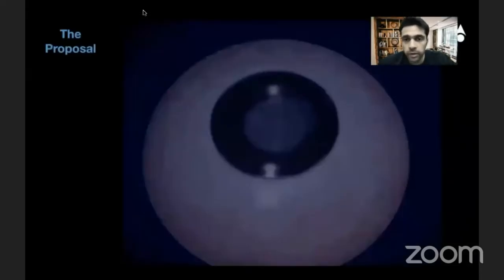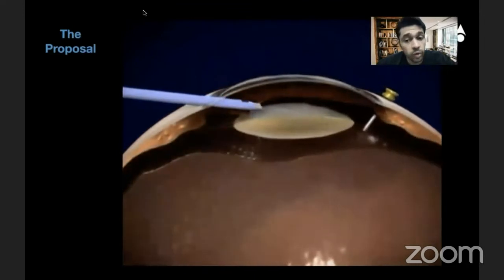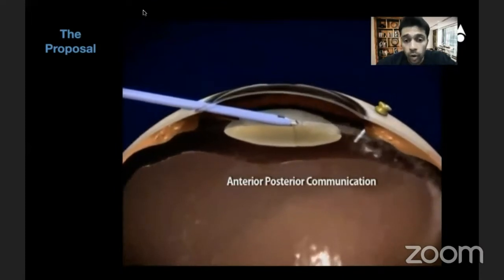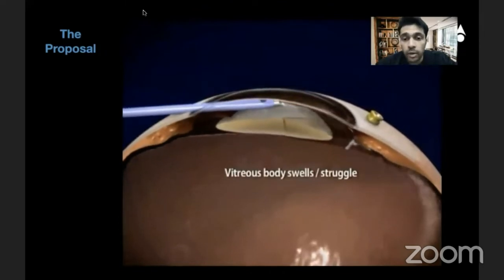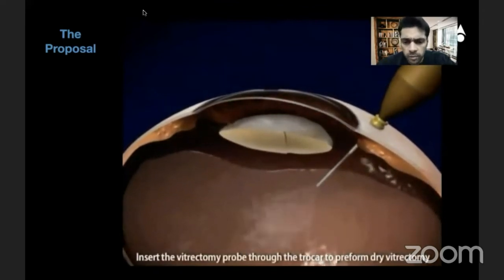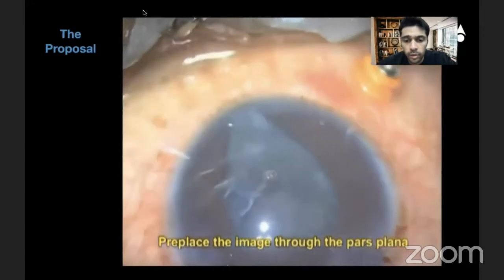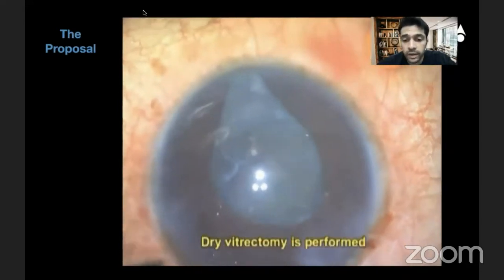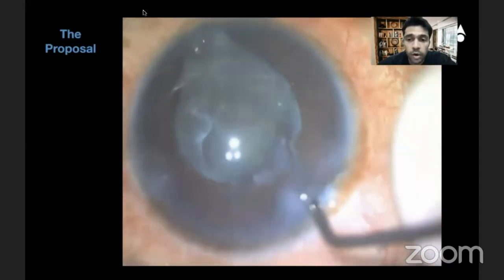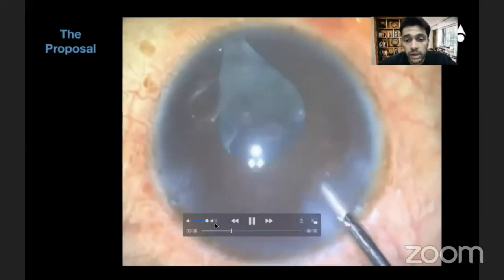The proposal I have started is to pre-place a trocar and then begin FACO emulsification. So when BSS is going in and swelling the vitreous body and my anterior chamber starts becoming shallower, I have the option of going in and doing a simple dry vitrectomy for seven to eight seconds at 1500 cut rate. Once done, I can easily go inside and emulsify the remaining pieces. I can do this intermittently. The same case — all I did was pre-place a trocar, go in with a dry vitrectomy, and completed my FACO emulsification safely and soundly.